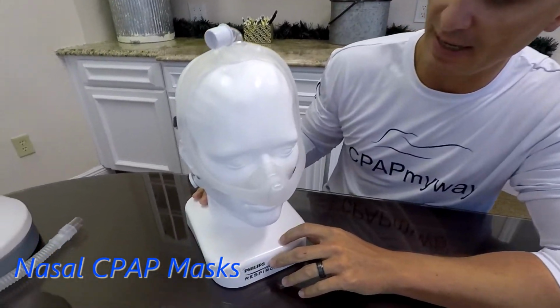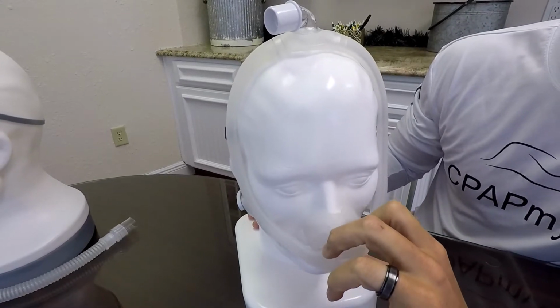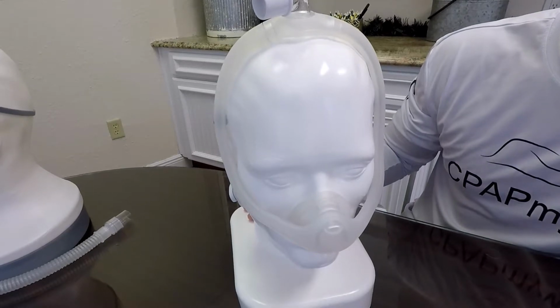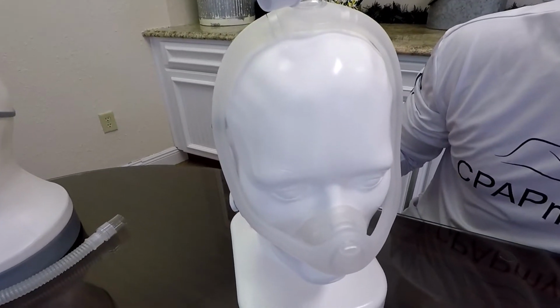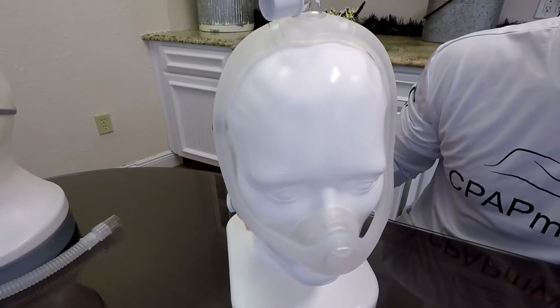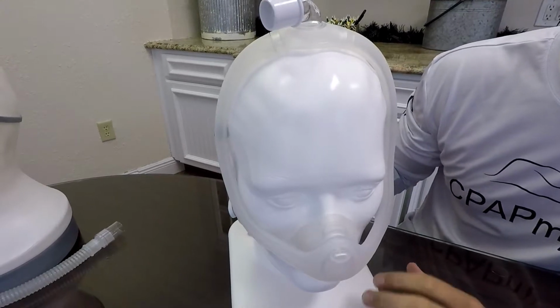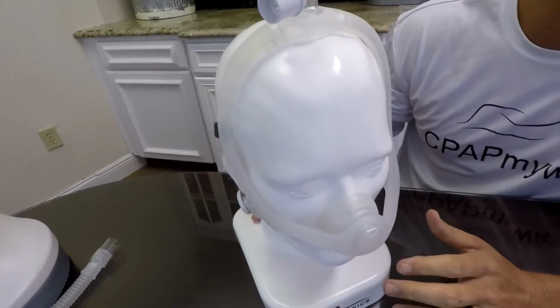Next up is the classic nasal CPAP mask. Nasal masks are defined by the fact that they typically rest around the nose, or at least up against the bottom of the nose. And they are typically a little bit easier to exhale with than the pillow version that we went over a little bit ago. It's a great middle of the road option in that it will work at pretty much any pressure and will work for almost anyone as long as you're not a mouth breather.